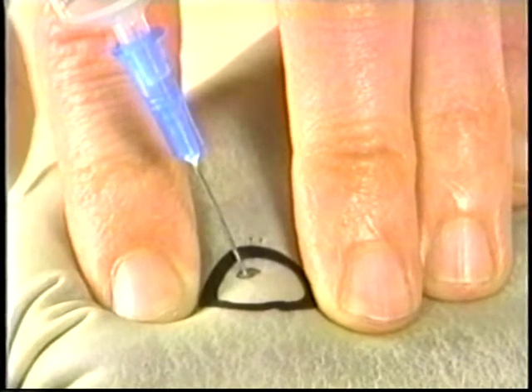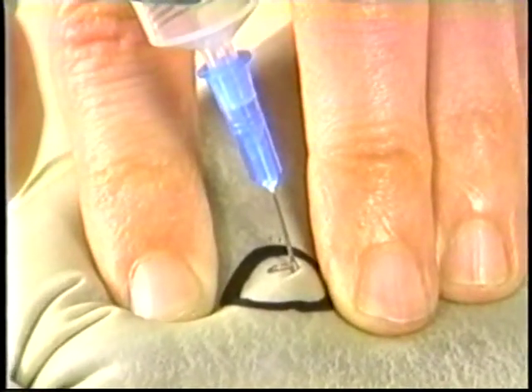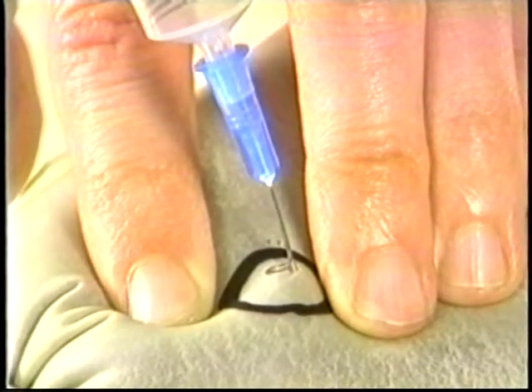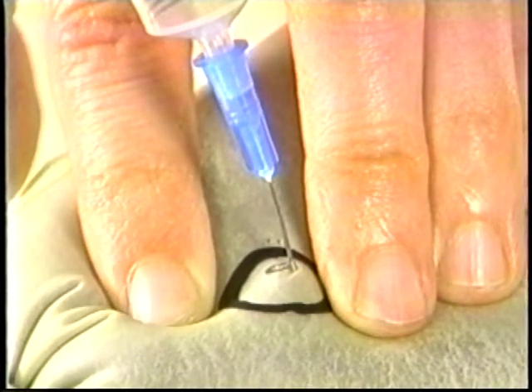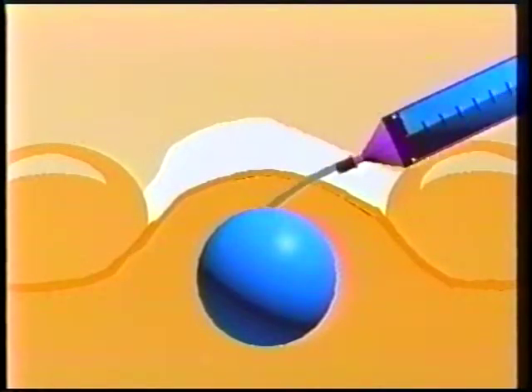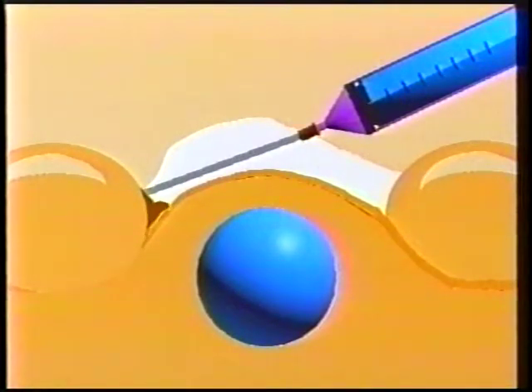The needle should slide in and out without sideways pressure. If the needle appears bent, or if the glove surface is wrinkled on one side, it is a sign of sideways pressure. Sideways pressure is dangerous to the operator because should the needle slip out, it could easily injure one of the fingers stabilizing the target.